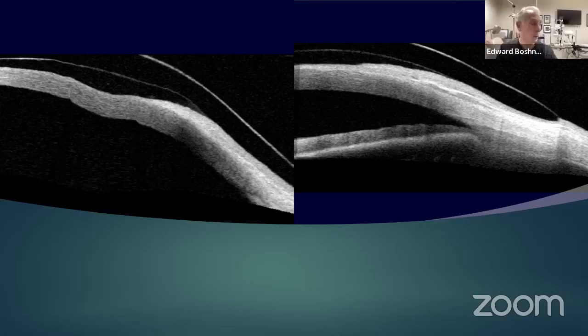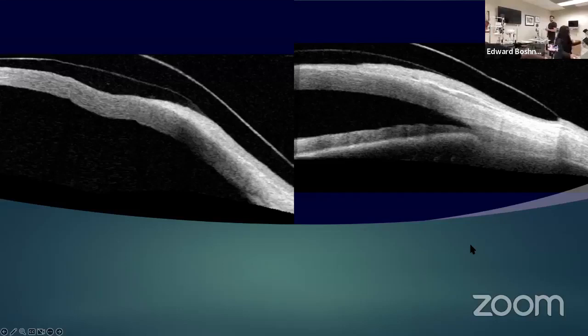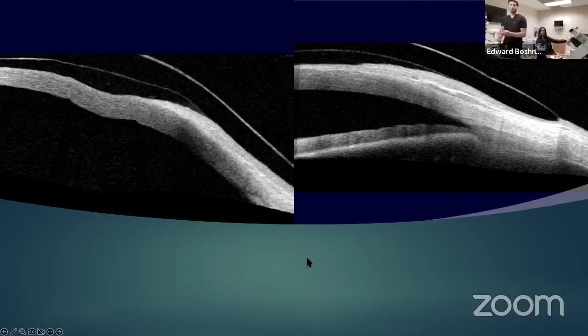Can I turn this around so they can see? Look, can you see? This is my anterior seg OCT. Can you point to it? That's my anterior seg OCT. It's right near my chair, so it sits around 7 or 8 feet away.